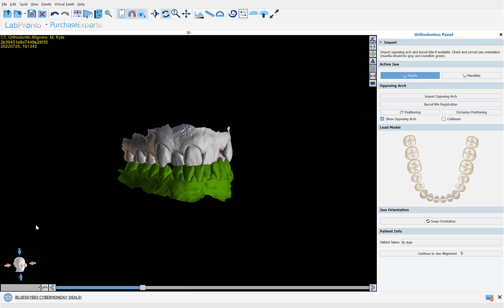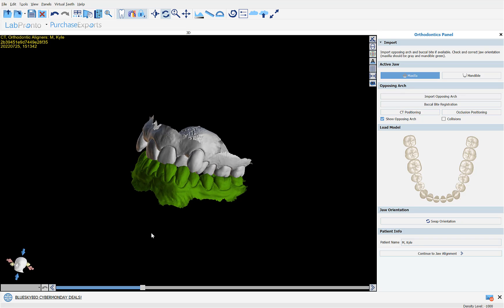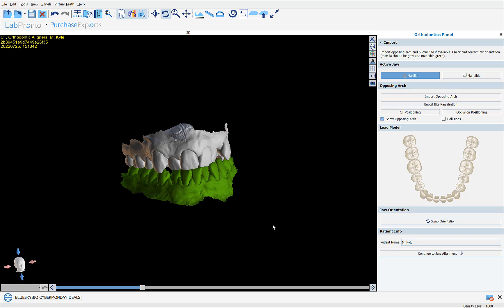If the STL models were not in occlusion, we could use this step to import a buccal bite to do the proper registration. In our situation, since the models are in occlusion, I'm going to click continue to draw alignment.